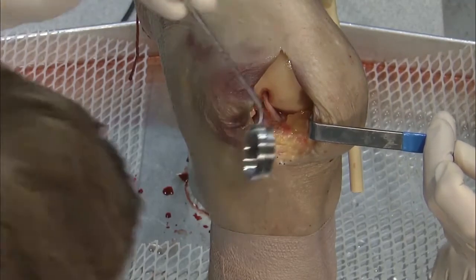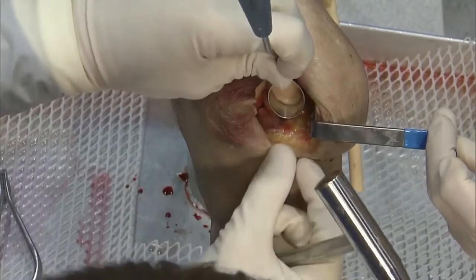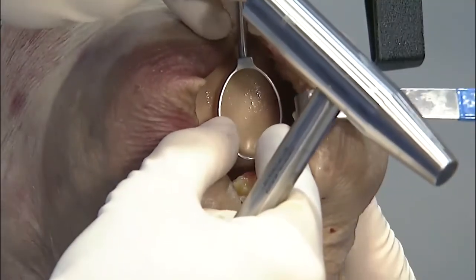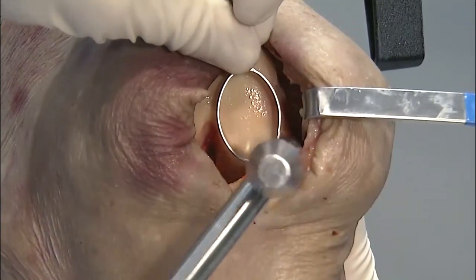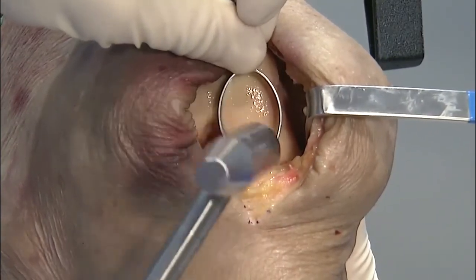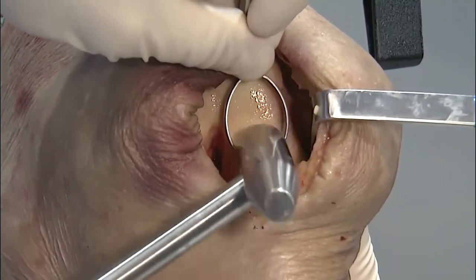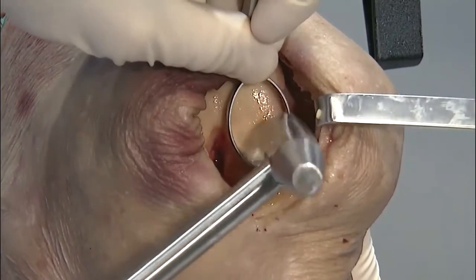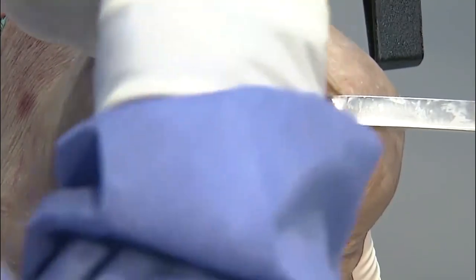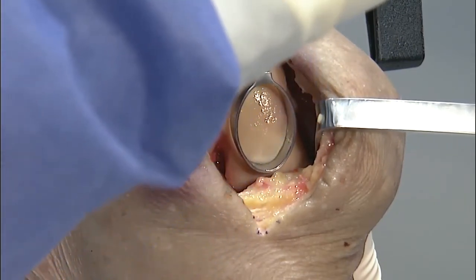Yeah, and it's really crucial that these are sharp. No matter what you're using, dull instruments will make everything much more difficult. So here we'll have a contained lesion. And if you don't have these instruments, there are other methods you can use too, like the 15-blade knife, so you can go around. But either way, you want to develop sharp edges first, and usually it's easier to do that with a sharp device, rather than the curette, to really make a perimeter.